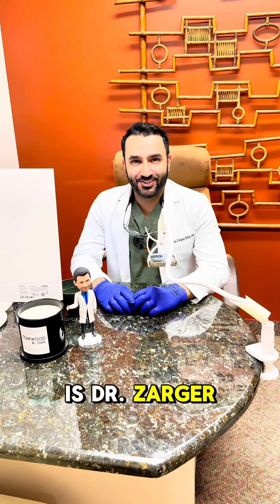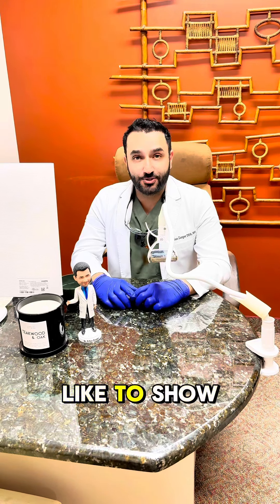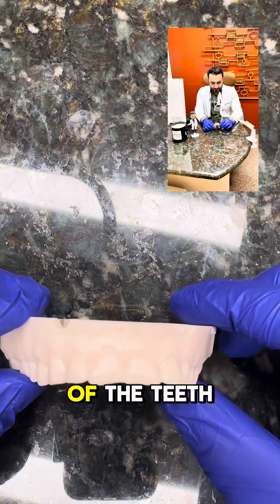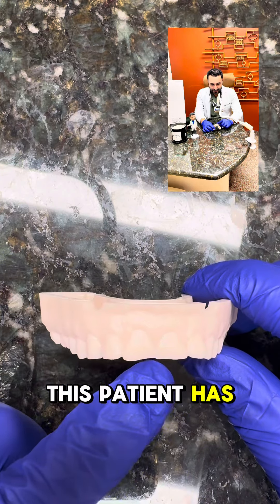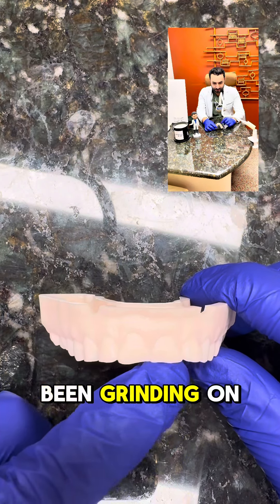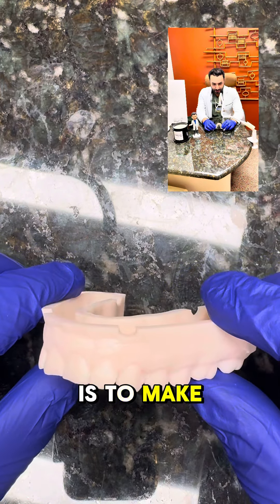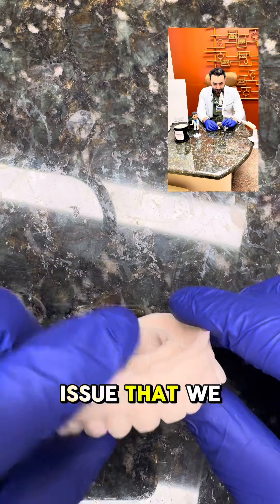Hi everyone, this is Dr. Zargar at Potomac Dental and Implant Center. Today I would like to show you the type of night guard that we make here. This is a 3D printed model of the teeth. Look at the teeth — this patient has short and flat front teeth. That tells me the patient has been grinding on their teeth for a while. So the first step to fix this issue is to make a night guard perfectly fit for the type of issue that we have here.